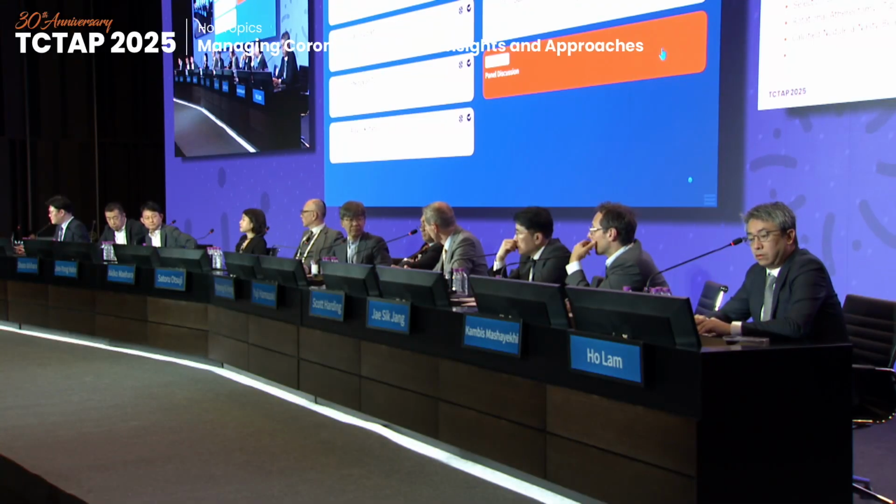We had a very nice lecture from Dr. Shin on calcified nodules, and he explained that even with the non-eruptive calcified nodule, about 2/3 of them were deformable and maybe 1/3 weren't, and that it was very difficult to distinguish between the two, maybe only with a balloon. But obviously there have been some publications on dark nodules or light attenuation. Do you think we can use light attenuation or the so-called dark nodule to predict expansion?